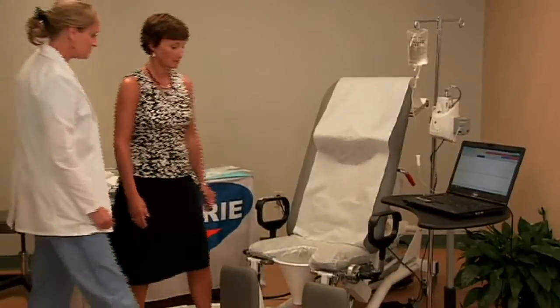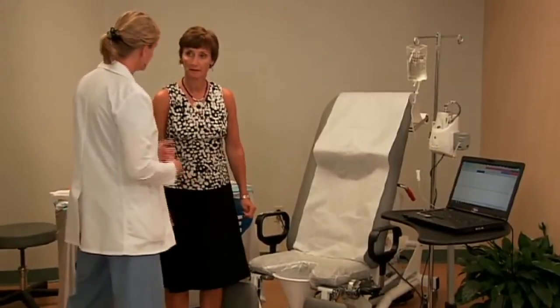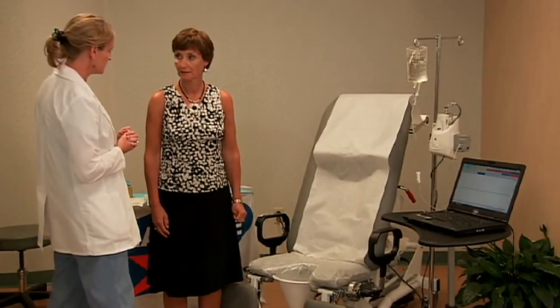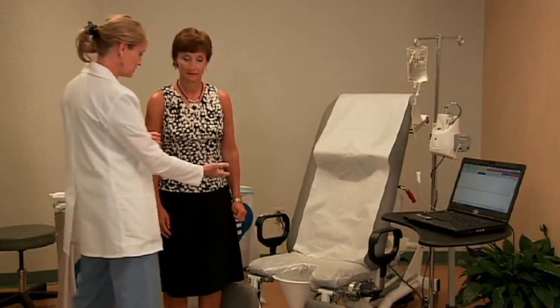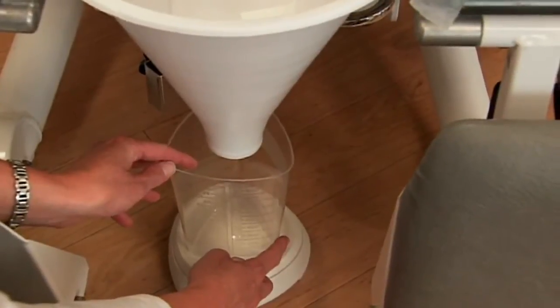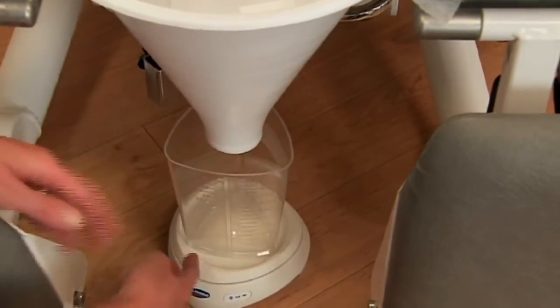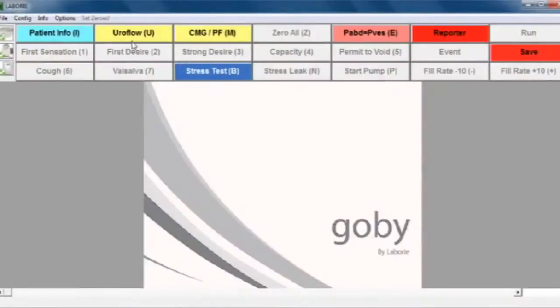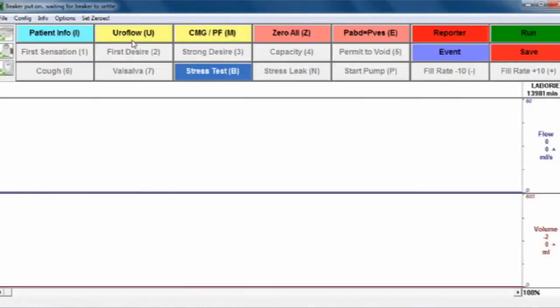Now you're ready for your patient. The first test you'll usually perform is Uroflow. Be sure to place the beaker properly under the funnel. On your laptop, click on the next button, which is Uroflow.